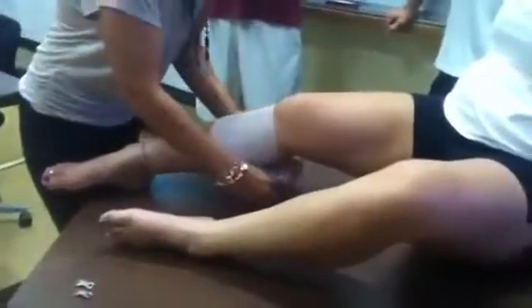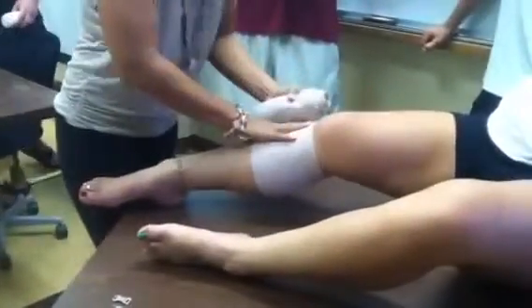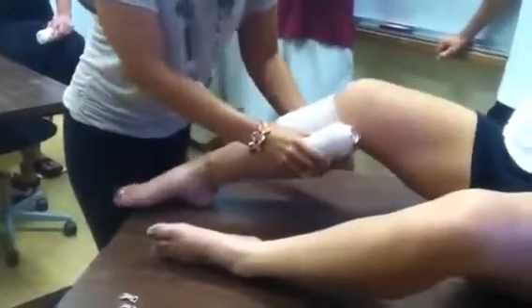For knee support, I'm using a double length, double width. We're going to go nice and tight, anchor distal away from the injury. We're going to go two, and I have a slight bend in the knee.